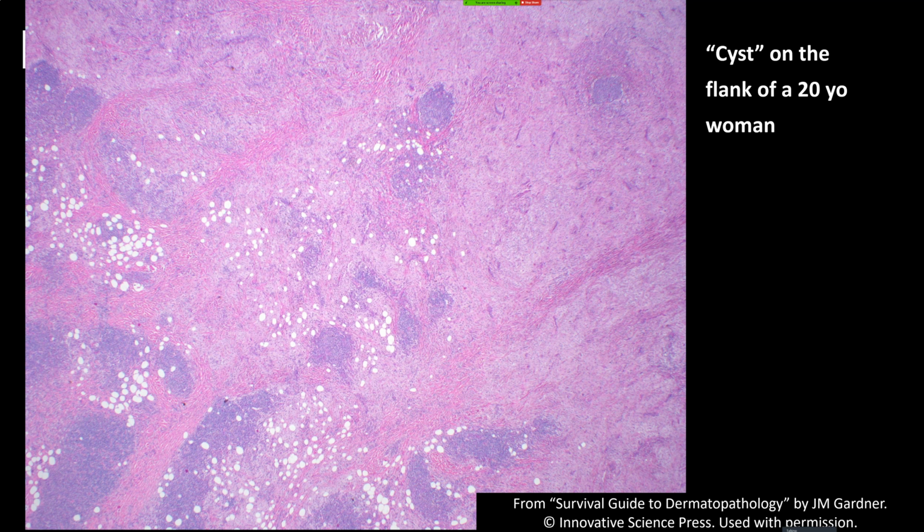All right. Rosai-Dorfman disease, an important one to know, also known by the name of sinus histiocytosis with massive lymphadenopathy when it occurs in lymph nodes. Obviously, that name doesn't really make sense when it occurs in soft tissue, which is the main time that I encounter it. All right. So what you see from low power, my former fellow, Dr. Betsy Uhlenhake, she liked to say pink and blue, baby. So there's a shout out for Betsy, who's an awesome fellow.